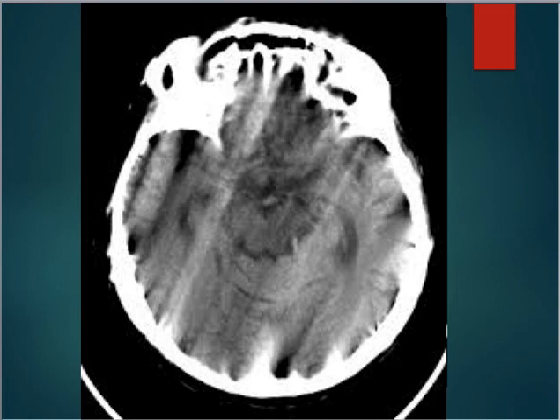This is actually an artifact. This is motion. So this is what happens when a patient moves during the scan. That's why it's vital for them to hold still, because this is non-diagnostic. The radiologist can't see anything going on with this, so we would have to repeat the scan.